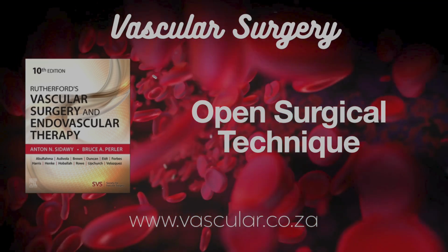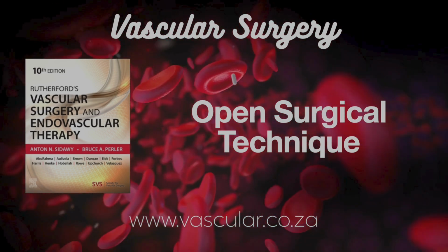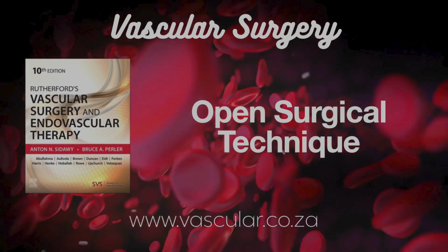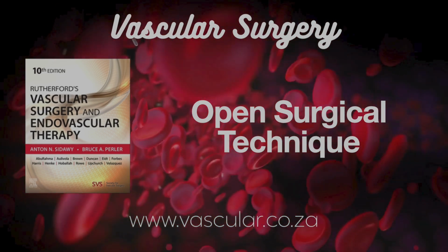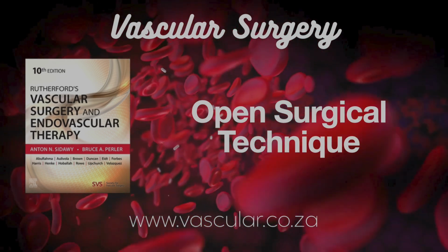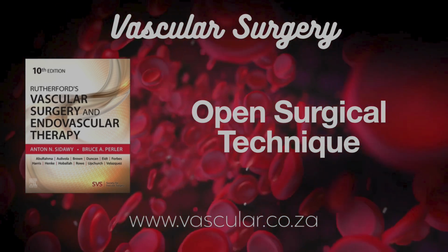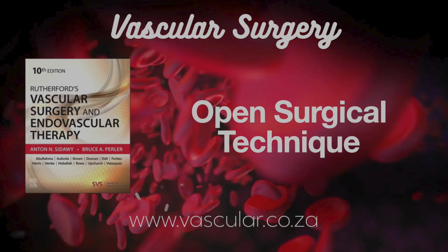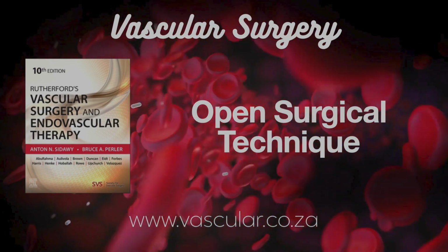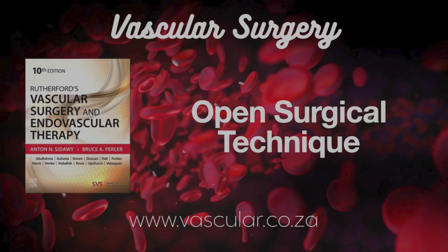St. Mary's boot. Similar start to Miller, but the corner of the veins is sewn to the arteriotomy apex, toe. Redundant vein excised obliquely, posterior collar incised, aims for a compliant collar, avoids artery-graft contact, maybe better hemodynamics, technically demanding. Distal vein patch, Linton patch. Shorter arteriotomy, less vein needed. Vein segment opened, sewn to arteriotomy as a parachute. Graft then sewn to a longitudinal opening in the proximal part of the patch. Vein tissue interposed between graft and the entire artery circumference at the toe.